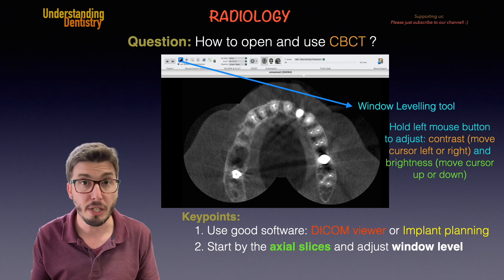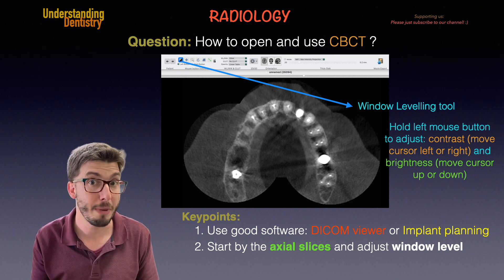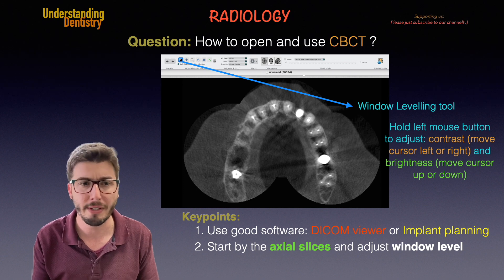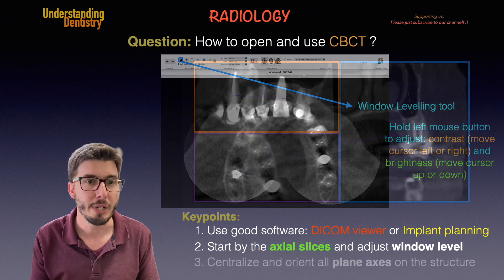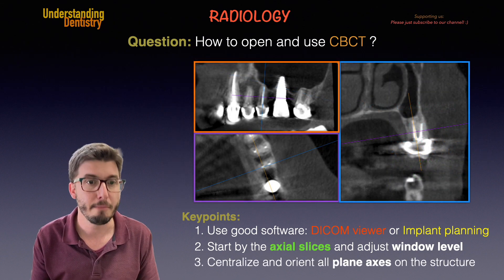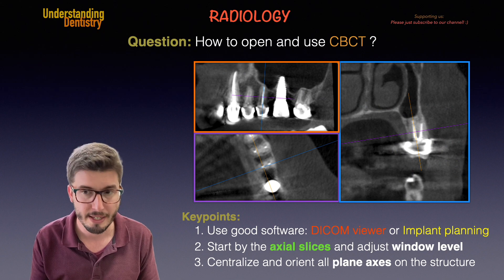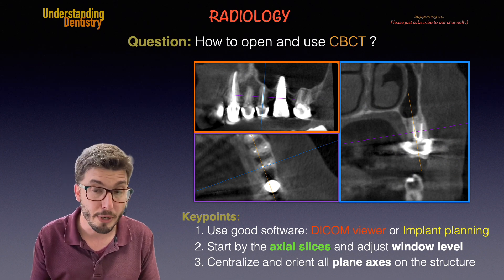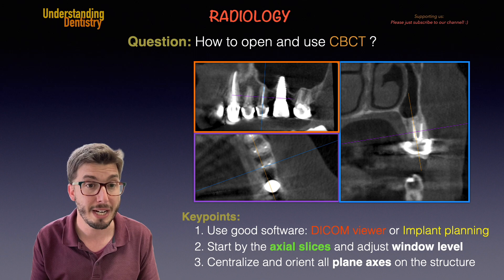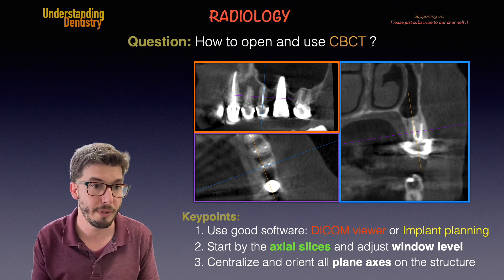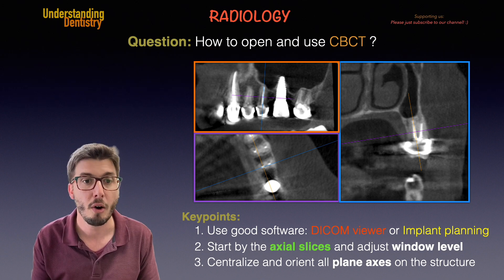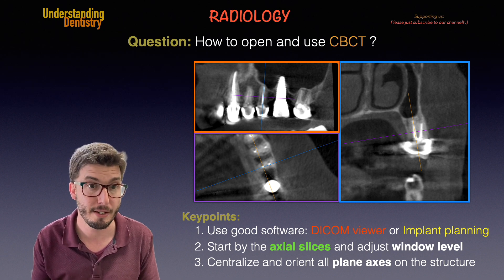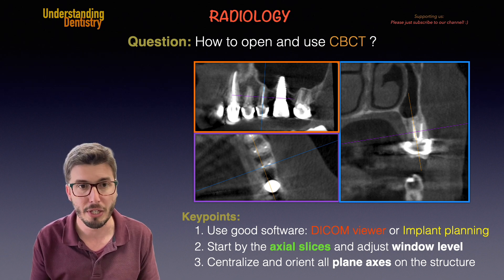You are going to find the main conditions you want to diagnose on the multiplanar reconstruction. The next step is to open the 3D MPR — the multiplanar reconstruction. The third key point is that we need to centralize and orient all axes of the planes on the anatomical structure that we want to assess.